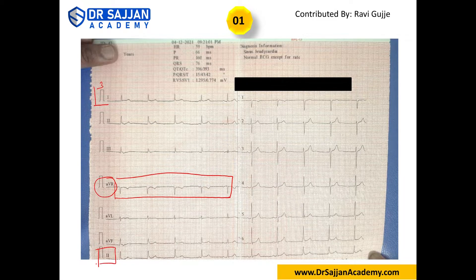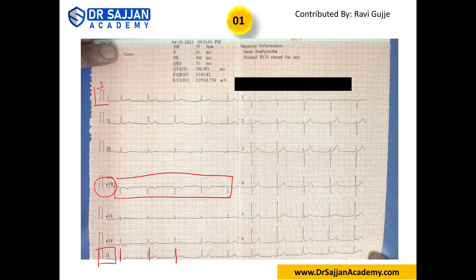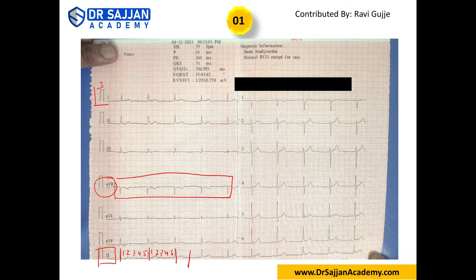The third point is rhythm, which we assess in lead two — the long strip. We measure from the first R to the second R, then second R to third R, counting boxes to determine regularity. Looking at the rhythm: one, two, three, four, five — and again one, two, three, four, five. It's five boxes every time, so the rhythm is regular.